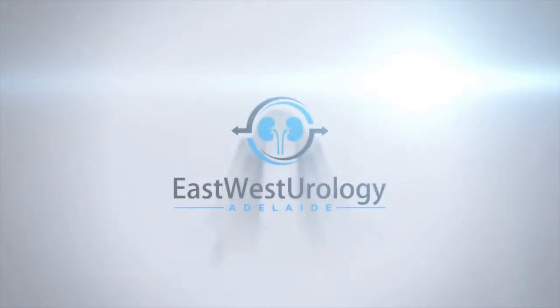This video is for general practitioners and nurses who give hormone injections for prostate cancer. It shows how to give Lucrine by intramuscular injection. I'm Nick Brook, urologist with East-West Urology in Adelaide.